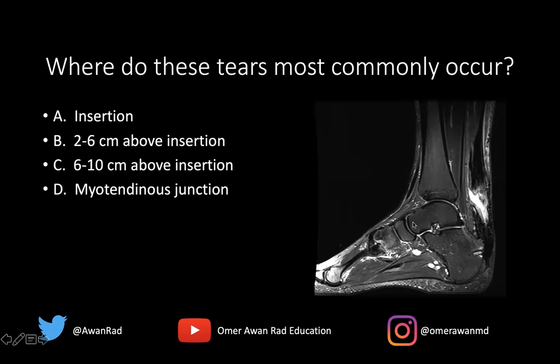Looking at this sagittal T2 FATSAT image, this is the tibia, the talus, the calcaneus. Here we have this dark structure — the Achilles tendon — inserting onto the calcaneal tuberosity. We can see T2 hyperintense fluid signal within the substance of the tendon. It's a full thickness tear because it involves the entire thickness from the anterior to the posterior dimension of the tendon. This is the most common place where the tendon tears, as this is an area of hypovascularity 2 to 6 centimeters above the insertion — by far the most common location for Achilles tendon tears.